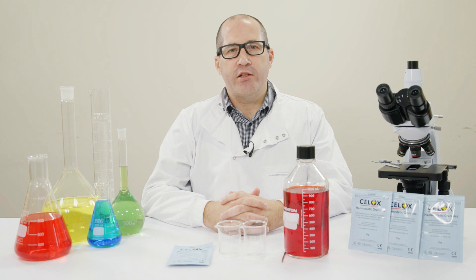Welcome to the CELOX Academy and the science behind CELOX. In this first video we are going to talk about CELOX granules and demonstrate how they stop bleeding. CELOX granules are a chitosan derivative manufactured from the shells of a particular species of shrimp harvested in the North Atlantic to ensure purity and effectiveness.